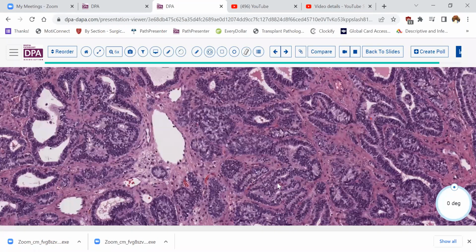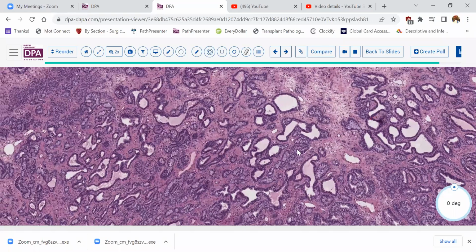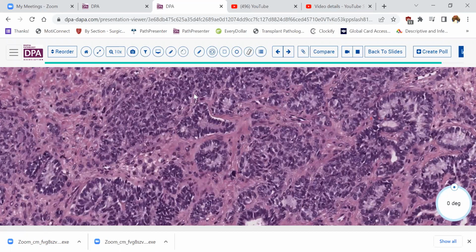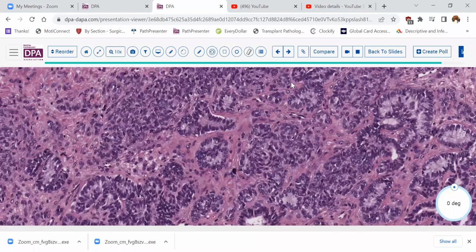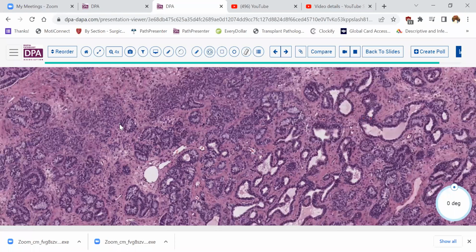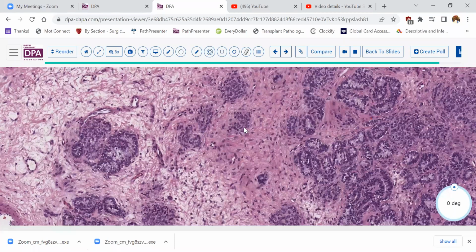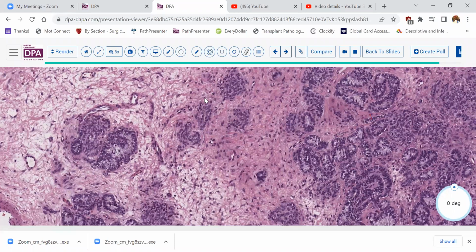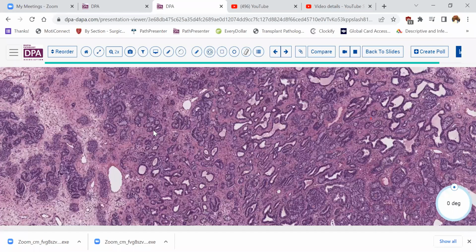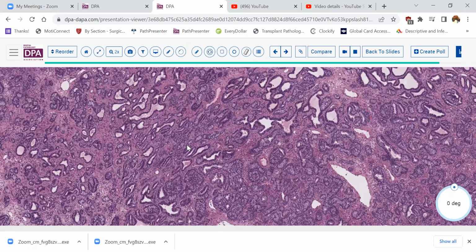Now, we also have, in this lesion, some small, more tubular type structures, as you see here, and a little bit of diffuse interstitial pattern of cells, somewhat similar in morphology. So some variability in the architecture. You can see some of these kind of nests here, not as well formed into tubules or pseudoglandular forms. So we have what looks like a tubular pattern that would fit nicely with a Sertoli cell tumor.